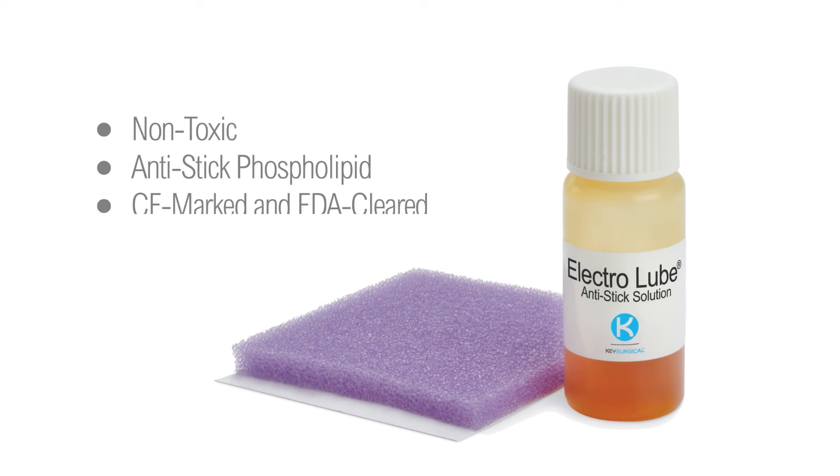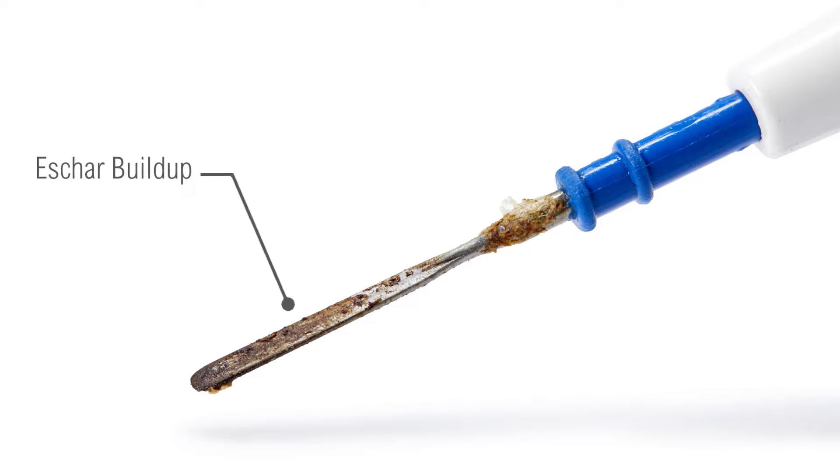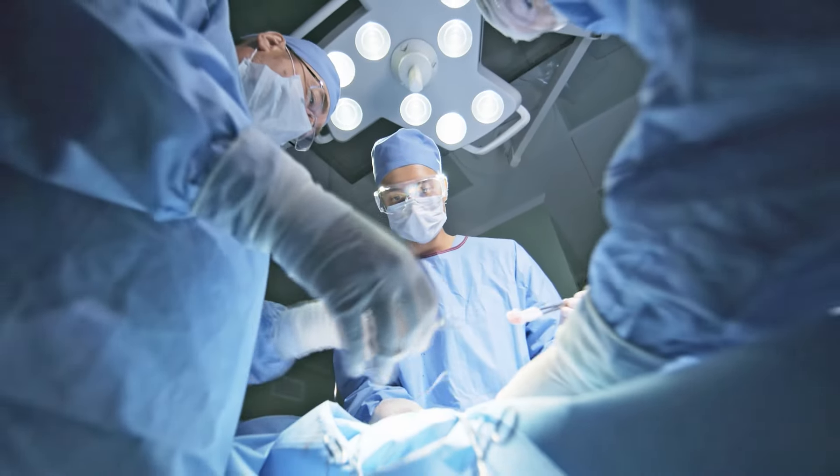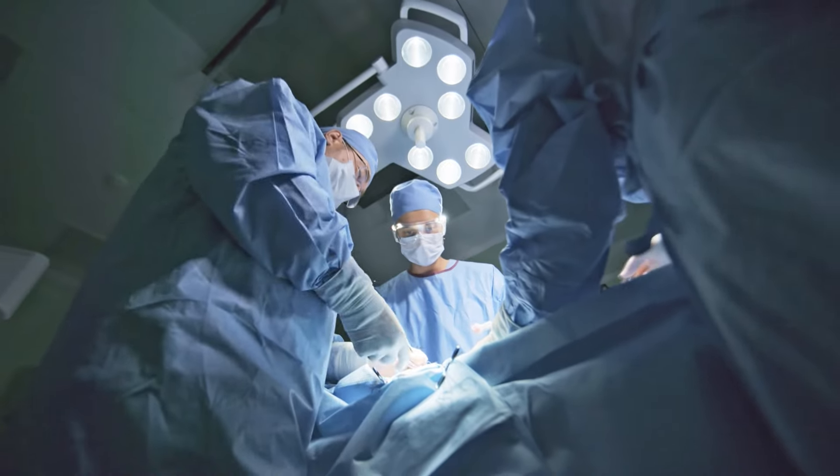Electrolube is a non-toxic anti-stick phospholipid for electrosurgery, designed to protect against the adhesion and buildup of eschar to the instrument, allowing you to remain focused on positive surgical outcomes and patient safety.